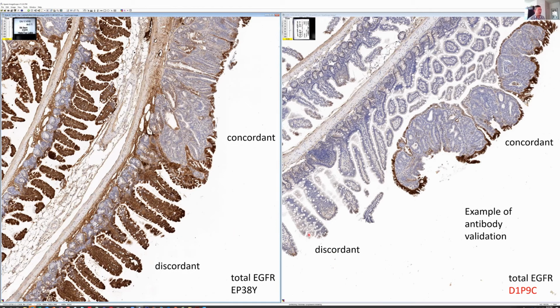So finally I broke the tie with some nice EGFR GFP expression analysis that truly showed that in the normal axis, EGFR signaling should be more located in the crypts, so I believe that this one on the left is inaccurate. But again, these are all multi-year efforts, so it's taking a while, but I just don't want to read out incorrect results.